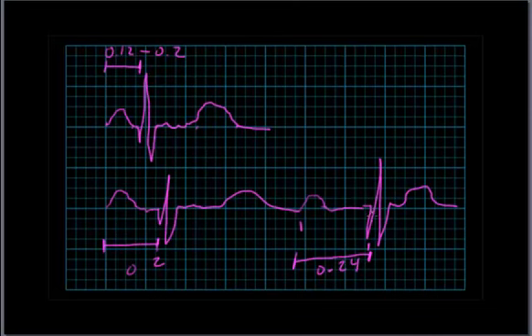So that would be very simplified. Cardiologists, if you're watching this, don't fuss at me. This is for introductory A&P students. Okay, so that's an elongation of the PR interval.